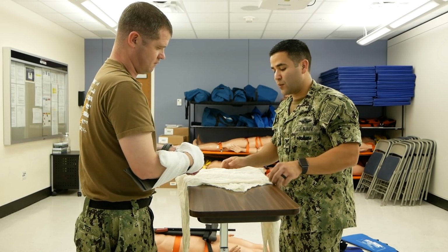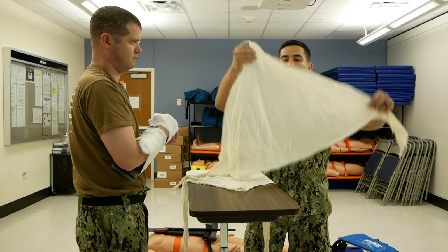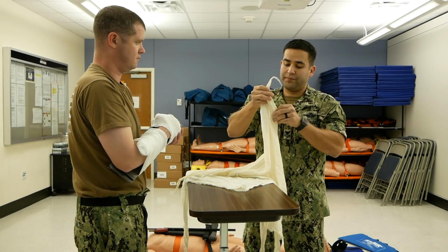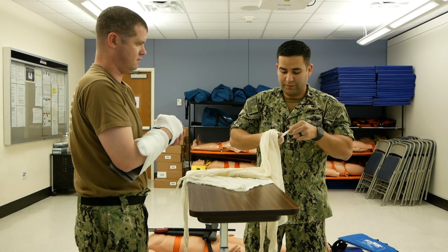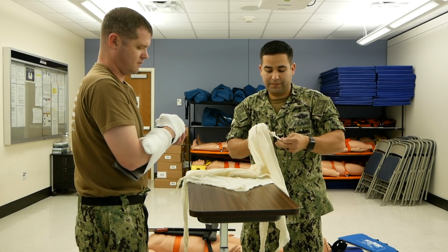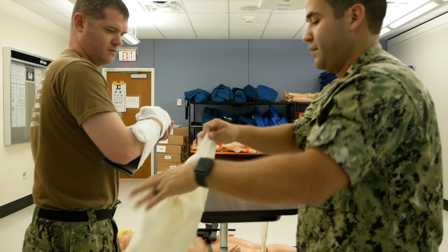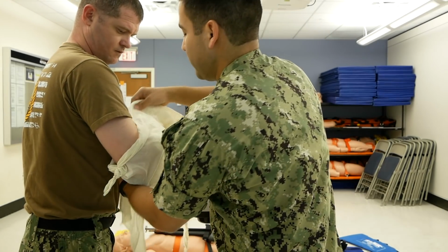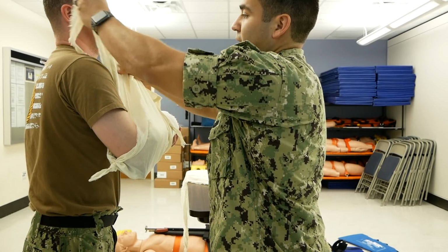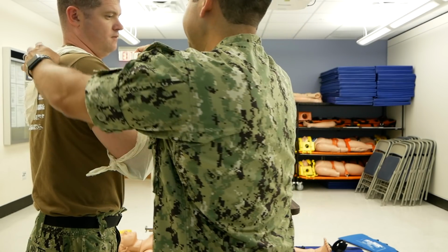Now we're going to go ahead and sling and swath. Here we have 2 triangle bandages. On one triangle bandage, you're going to go ahead and tie a knot at the end. Tie a knot, and that's where the elbow is going to rest. Rest the patient's elbow. The part of the triangle bandage that went underneath is going to go on the inside of the patient. It's going to go towards their affected side shoulder.